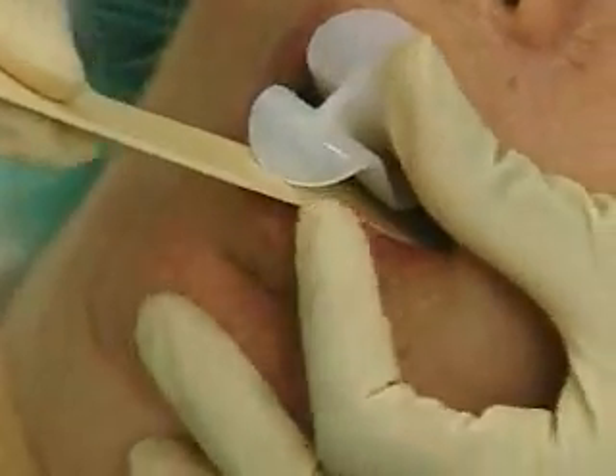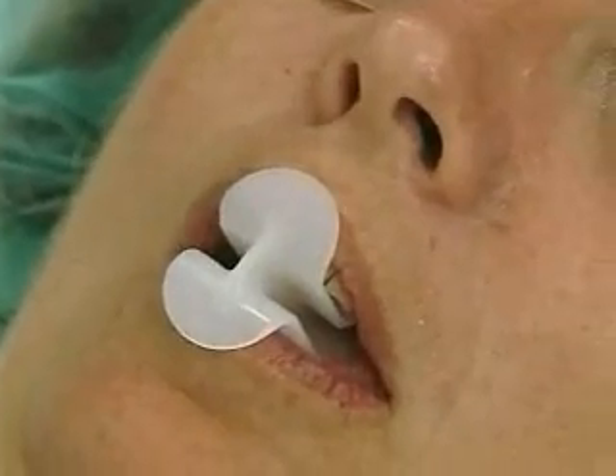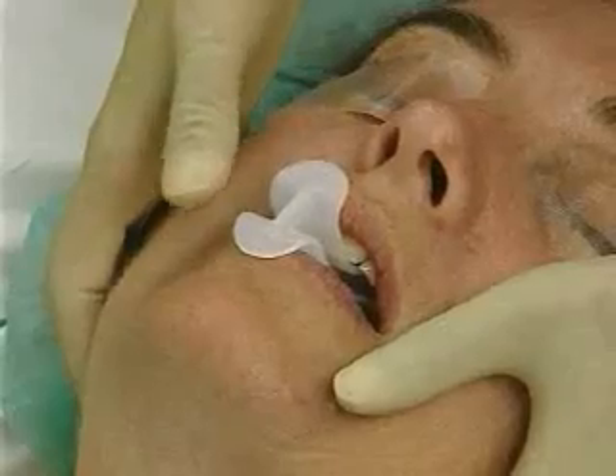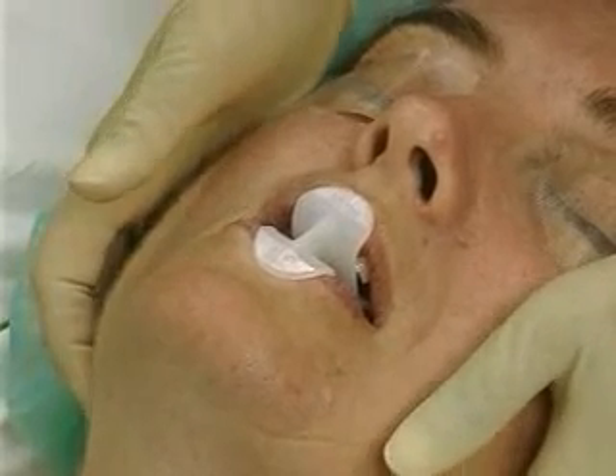The flange at one to two centimeters of the shaft of the airway should protrude above the incisors. Perform the jaw thrust maneuver to lift the tongue off the pharyngeal wall. Now tap the airway down the last two centimeters so that the curve lies beyond the base of the tongue.